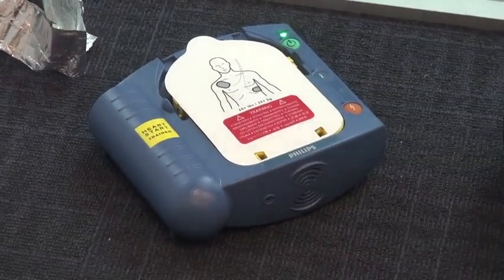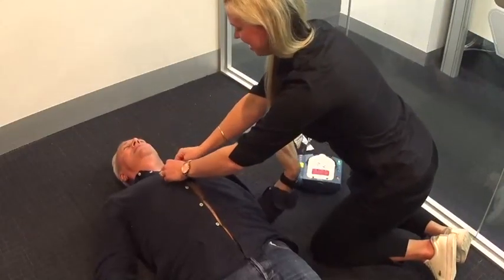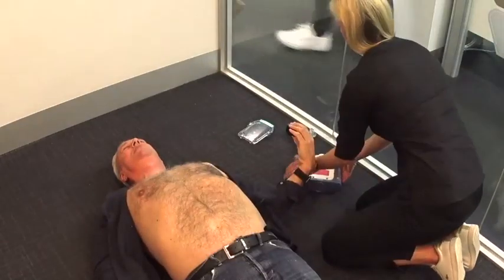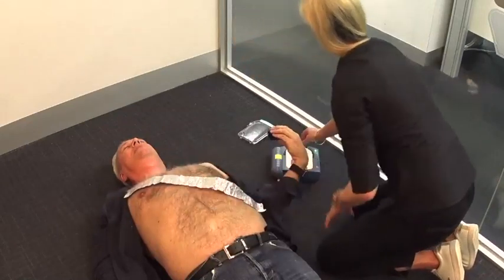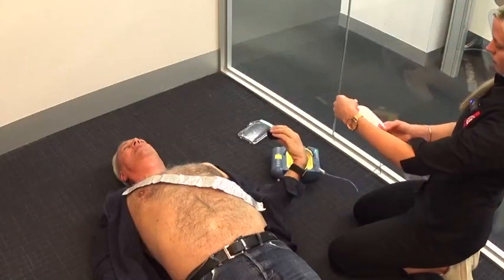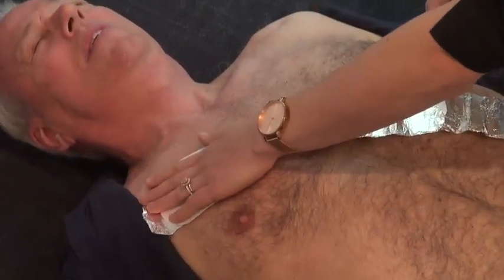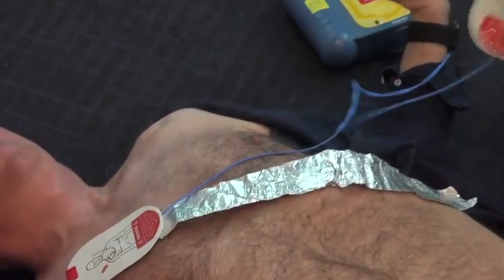Begin by removing all clothing from the patient's chest — cut clothing if needed. That's a very expensive shirt, so we're going to get this shirt off. When the patient's chest is bare, remove the protective cover and take a look carefully at the pictures on the white adhesive pads. Peel one pad from the yellow plastic liner and place the pad exactly as shown in the picture. Press firmly to the patient's chest. No one should touch the patient — analyzing.